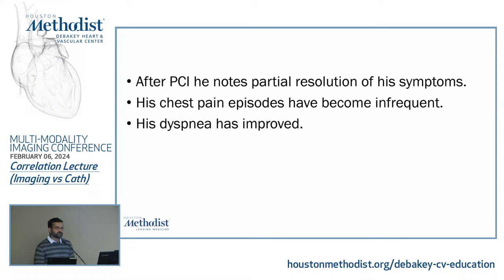Right, and the signal on the cine in the basal septum looked normal, or was there an increase in signal? I will have to go back and look at it. Yeah, because oftentimes just looking at that alone can tell you. When you see LGE, it could be chronic fibrosis from a variety of different etiologies, or it could be some acute process, right? So oftentimes the cine can be helpful in that setting. If the signal intensity is the same in that area as the rest of the myocardium, that suggests it's not an acute process, versus if you see an increase in signal.